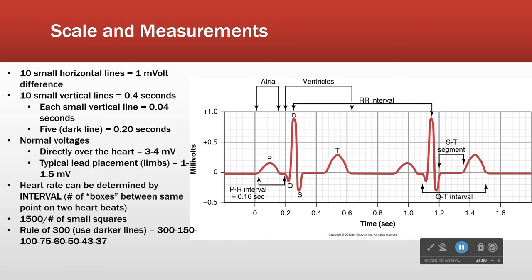Now, many of you have seen EKGs and you know that the computer puts a rate on it. All right, here's the thing. You're not going to like this. Don't trust the computer's rate. Here's why. The rate the computer picks out is perfect if it's a normal EKG. If the rhythm is disturbed, in other words, it's not a regular rhythm, the computer is guessing.